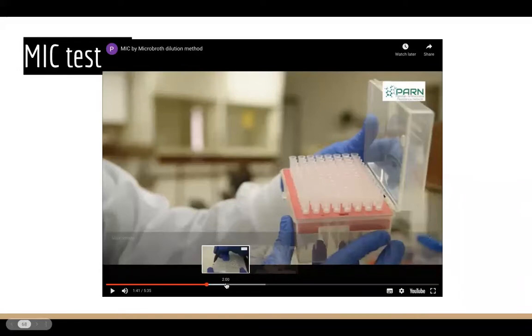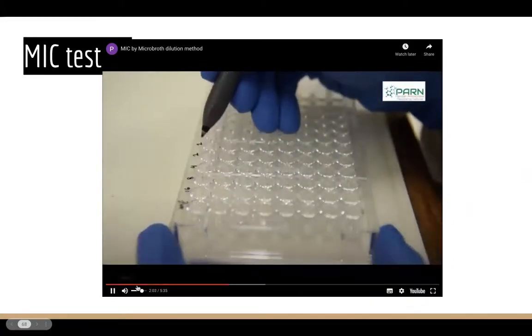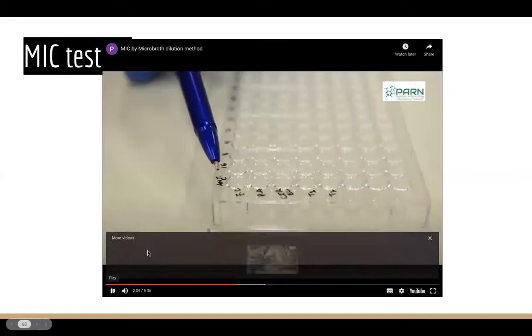Let's get on to the actual process itself. So once you've grown a culture of your bacteria in media, the range of antibiotic dilutions in the microtiter plate should be 2-fold higher than the actual working concentration. So you can see here they're doing 16, 8, 4. So they suggest that they're doing a 2 times dilution each time. So they're taking half of previous and then putting it in the next to reduce the concentration.